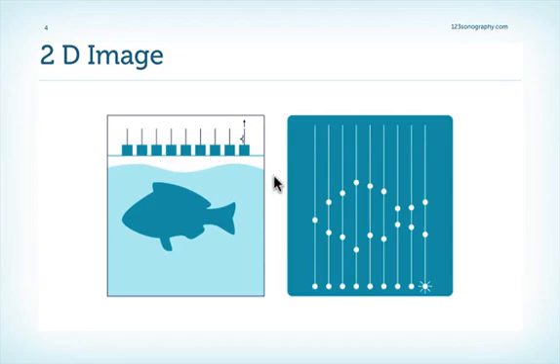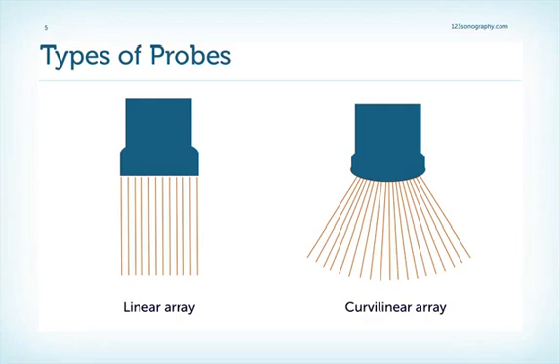Now, in a normal image, you will not notice that. It just goes so quickly that you have an entire picture in an instant. But on each boundary, we'll then get a reflection, and that is processed to an entire image.